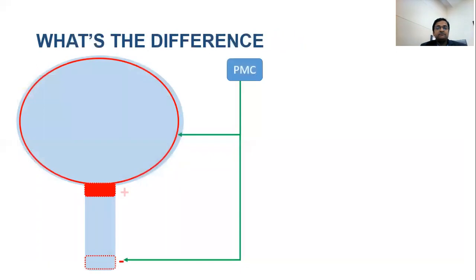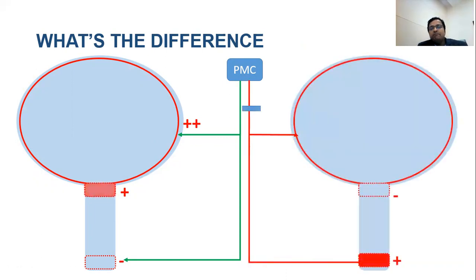outflow relation and measurement. Now, what's the difference in all of these 4 graphs? If you have an intact pontine micturition center and all the nerves peripherally, then in the presence of bladder neck obstruction, you will get high detrusor pressure because the detrusor is having to function against resistance. Whereas if the PMC is excluded from the bladder, you will have an external sphincter non-relaxation, and that will give rise to high pressures, not the internal sphincter, as long as the lesion is below T6 level, and that will be corroborated only by MCUG.